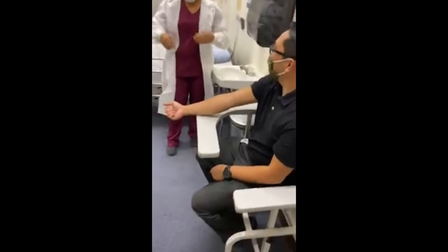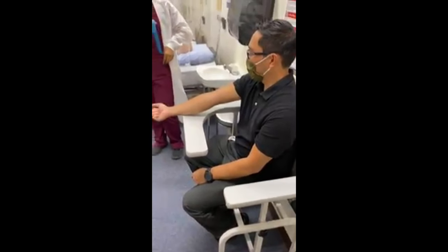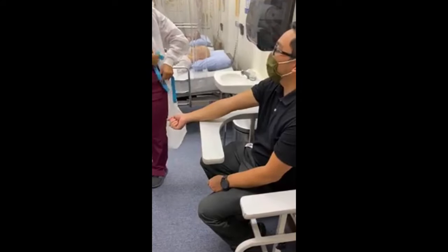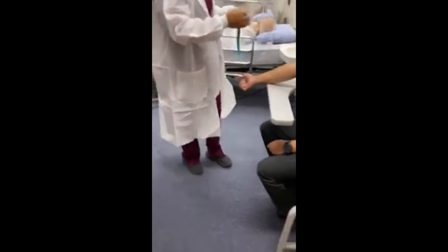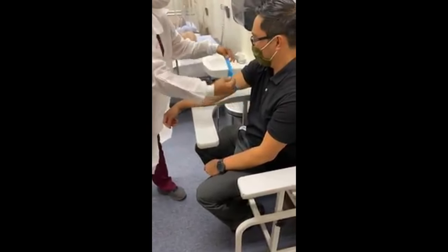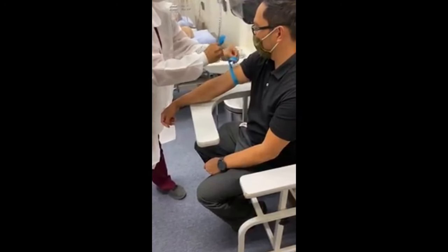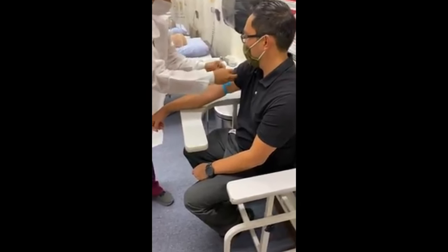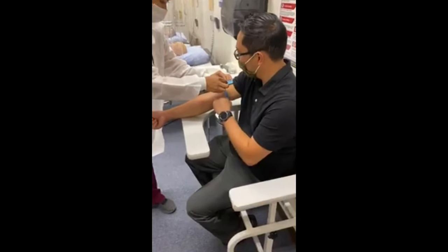Okay. You want to go next? Hi, sir. I'm just going to try to find the vein. It's a good placement, but just a little bit tighter.